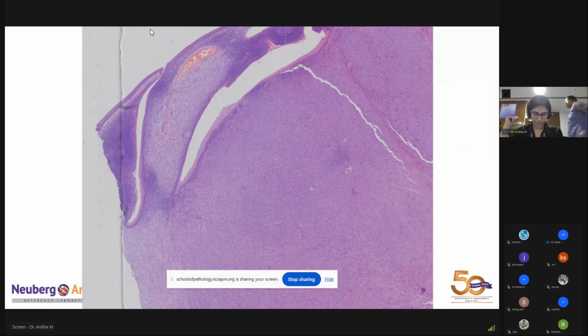Ma'am, the small lymphocytes I could see within the subepithelium tumor, and chronic inflammatory cells. But you started off your description saying that there are reactive lymphoid aggregates within the epithelium and then there is tumor. So what are those reactive lymphoid aggregates?